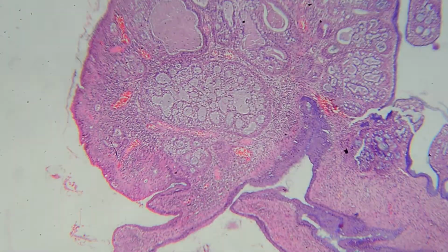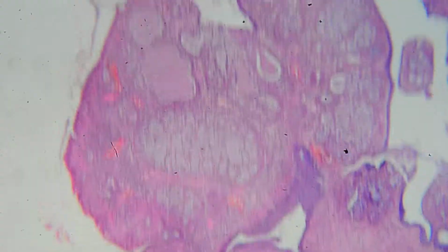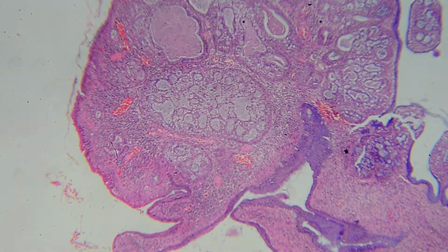So this one, endocervical polyp, you can see there's lots of these. The entire thing is a polypoid piece of tissue. Okay. And then when you look closer, you can see what type of lining it has.